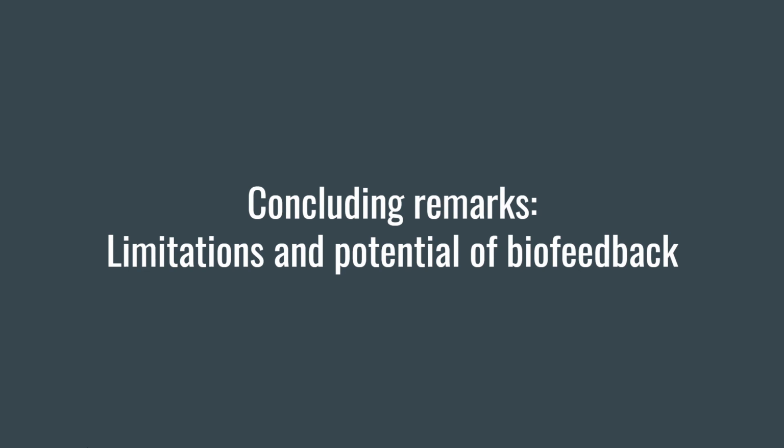In comparison to, for instance, deep brain stimulation, neurofeedback is a therapy process over not less than 15 to 20 sessions. Nonetheless, the method is non-invasive, which means there are no surgical risks, but also in general the method only has limited risks. The only thing potentially going wrong is constructing a wrong training protocol and not tweaking the right brain functions, resulting in undesirable outcomes such as nausea, anxiety, depression, or epileptic seizures. However, these side effects last only for a short period of time.